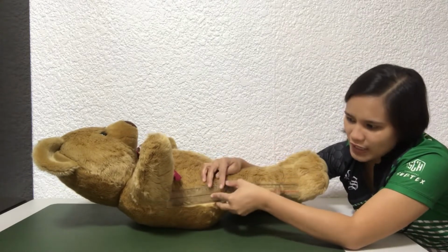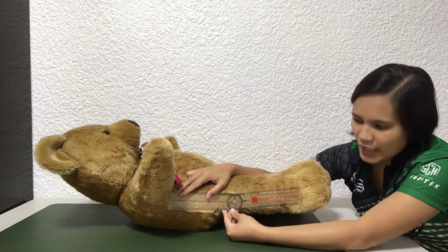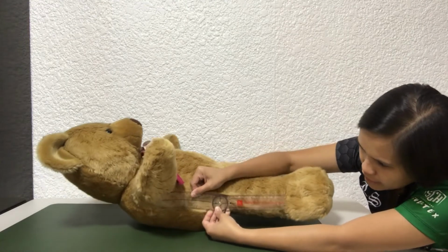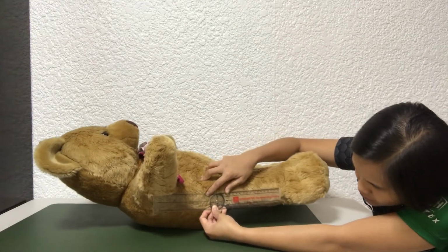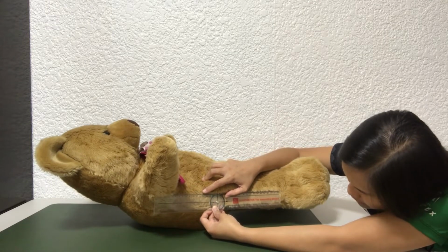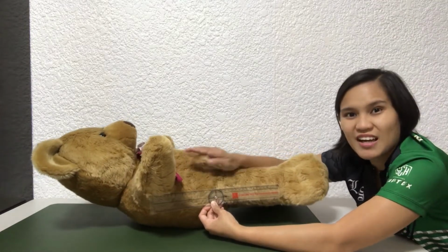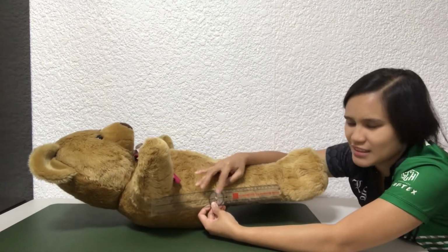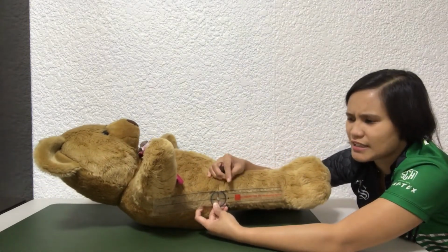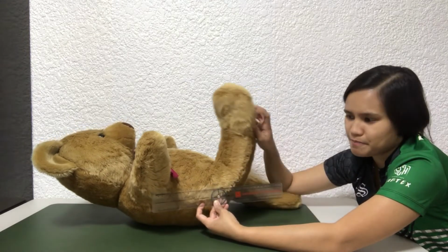First, you align the goniometer to the specific bony landmarks. And then you look at what is the specific measurement that we have here. So for Mr. Teddy, it starts at not zero, at least 5 degrees of flexion. So he is not at a flat zero, right? There are slight degrees of flexion or bend already on the hips of Mr. Teddy. And then, for example, we will ask the patient to flex the hip.